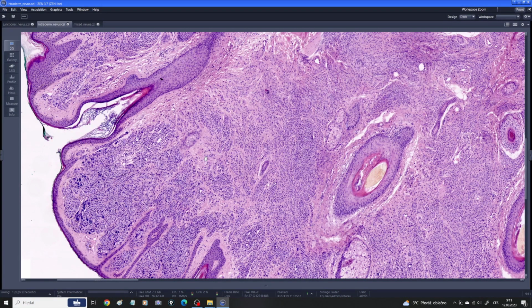And maybe you remember from embryology or histology that melanocytes originally come from the neural crest. And as the benign nevus matures, those melanocytes start to resemble neural cells. So they will look less like melanocytes, and more like Schwann cells, for example. So they will be smaller, more pale, and rather spindle-shaped.